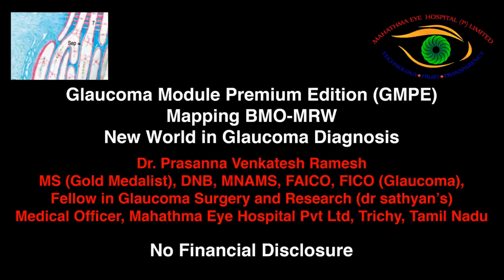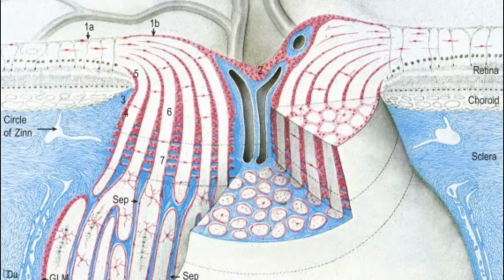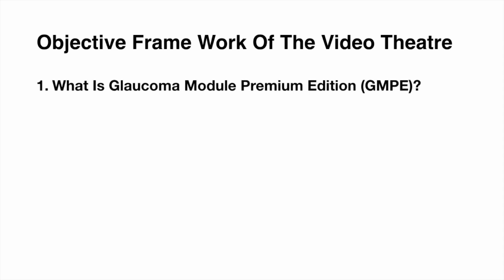Glaucoma Module Premium Edition. Mapping Bruch's membrane opening minimum rim width. New world in glaucoma diagnosis. No financial disclosure. The objective framework of this video theater involves what is Glaucoma Module Premium Edition, or GMPE.